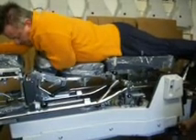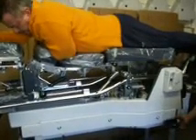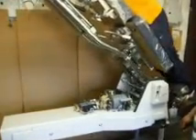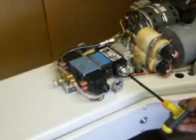Now at this point, we're going to transition back down and up in Hylo mode, because we've upset the VertiLift setting on the valve pack. We're going to see what the effect is. Next, we'll reestablish the setting on the valve pack in VertiLift mode back to the factory setting, and once again illustrate the total cycle under factory setting conditions.